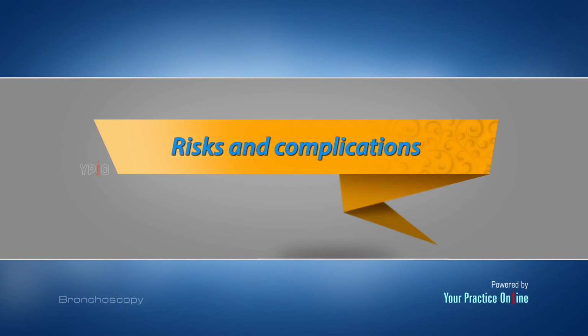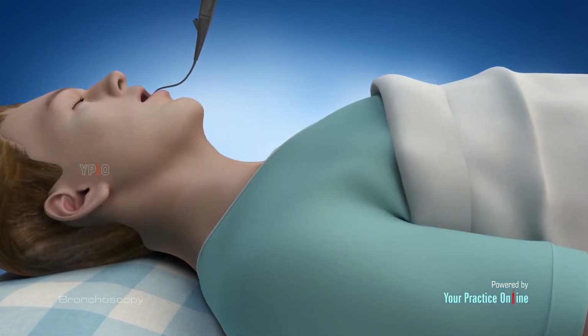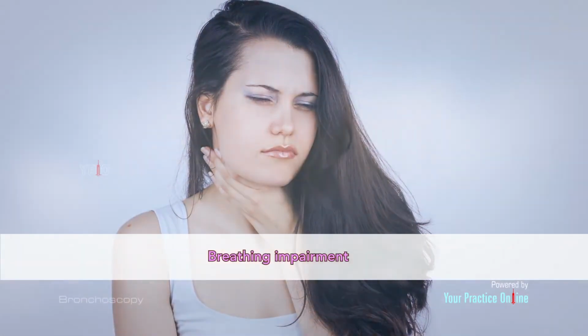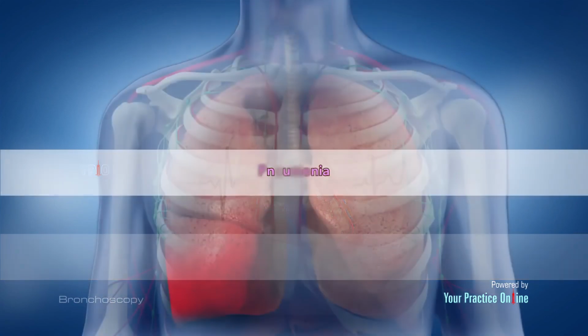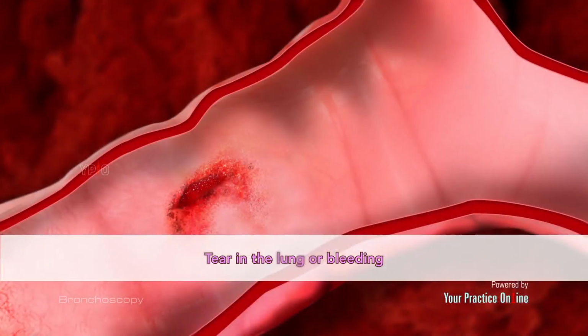Risks and complications. Bronchoscopy is generally a safe test, but as with any procedure, complications may occur and can include breathing impairment, arrhythmias or irregular heart rhythms, infection such as pneumonia, hoarseness, tear in the lung, or bleeding due to a biopsy instrument.